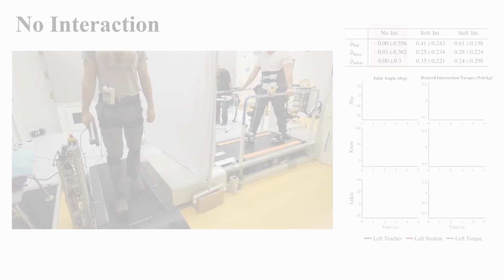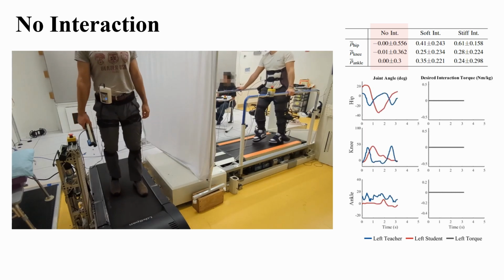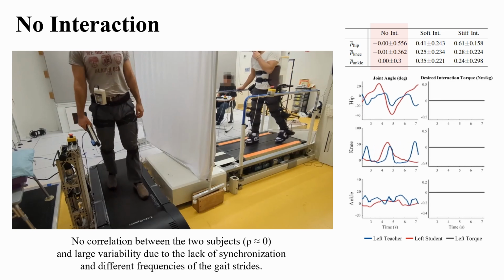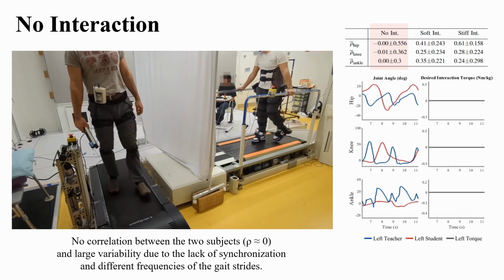This video demonstrates the walking patterns of the 2 users without the virtual interaction. Here, there is no correlation between the 2 users due to a lack of synchronization and different step frequencies, as no haptic cues were transmitted.